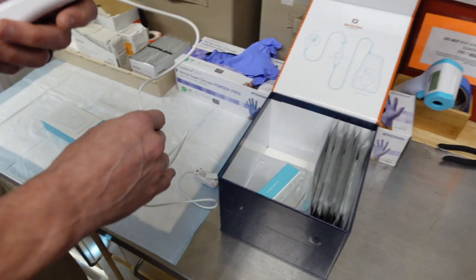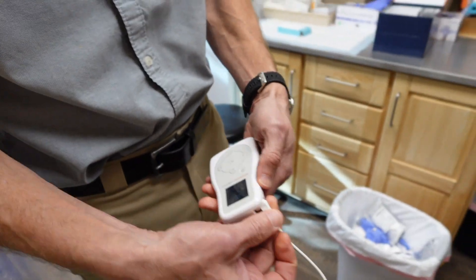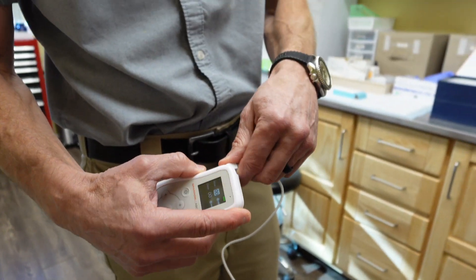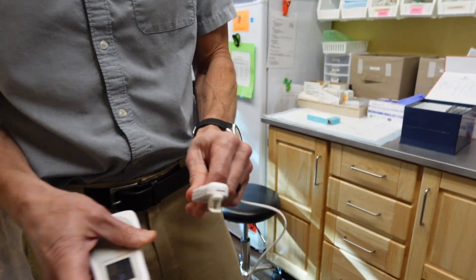I guess there are reasons for nerve stimulation. This is the device — we're going to show you how we get it on the patient. Pretty easy to use. The cable clicks in and out. The cable's one piece, the controller's one piece, and then the earpieces just clip into that little controller. The earpiece is very fragile, very delicate.